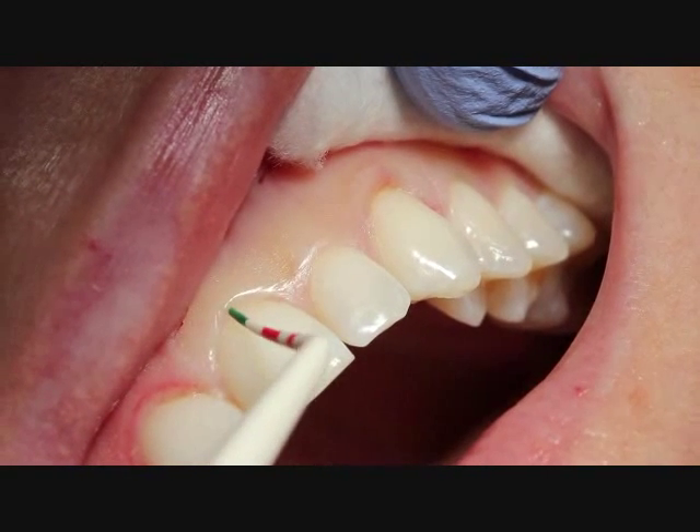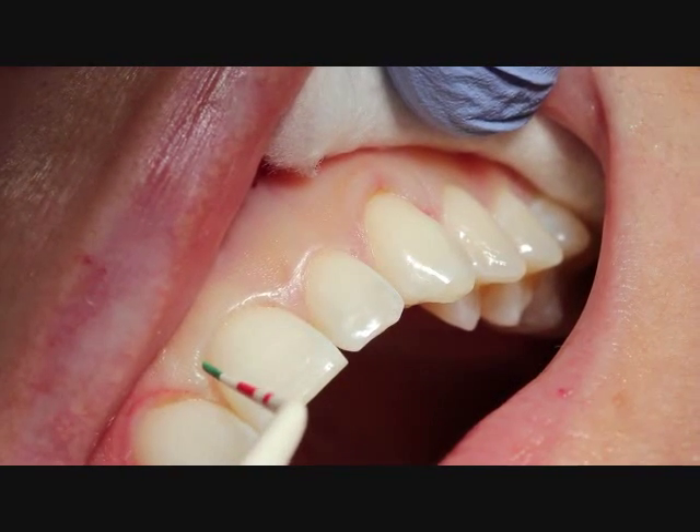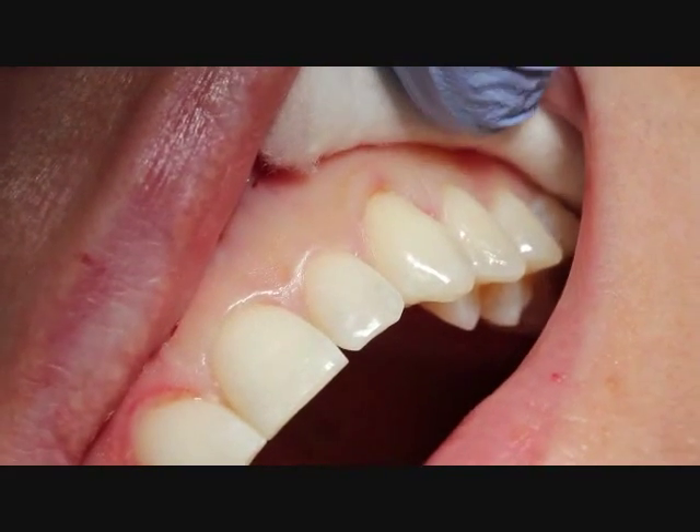When we look at our sulcus depth, we have to be aware that when we're just doing a soft tissue procedure, we will be limited to how much tissue we can actually take away.